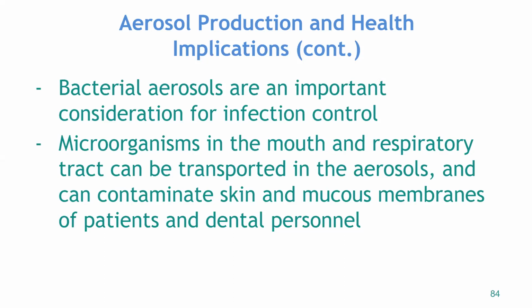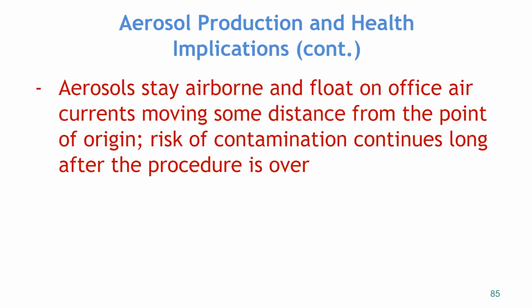Microorganisms of the mouth and respiratory tract can be transported into aerosols and can contaminate skin and mucous membranes of patients and dental personnel. They stay airborne and float in the office air currents, moving some distance from the point of origin. Risk of contamination continues long after the procedure is over.